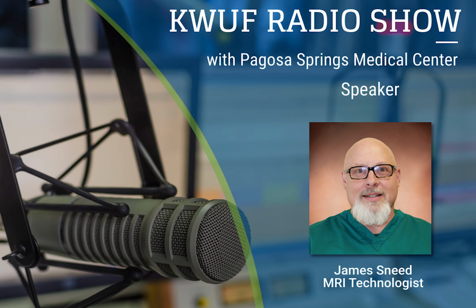It is a Siemens Altea. It is a 1.5 Tesla Magnetom, and it's a newly developed scanner. It has a big bore on it, which means a large opening. The tube is also much shorter, and it's open on both ends, and so is the entire room. And because of this, we've reduced our patient anxiety and claustrophobia approximately to 2%.